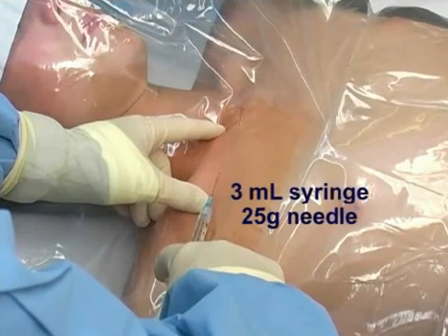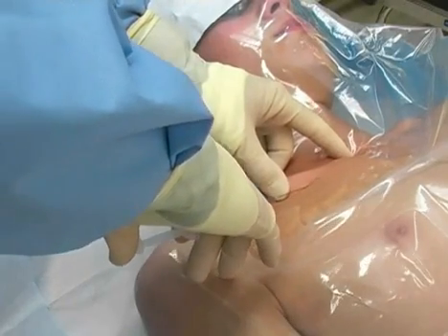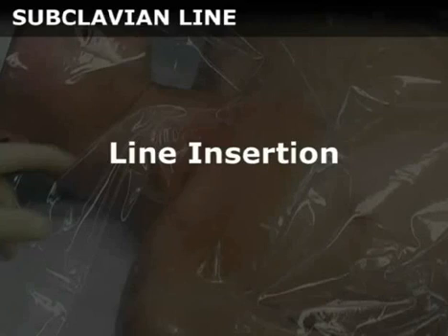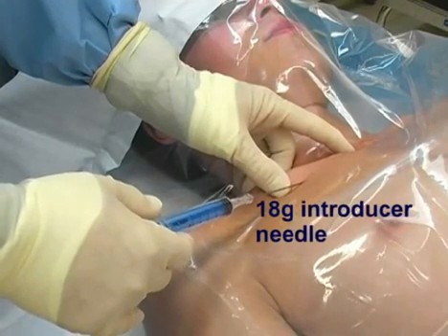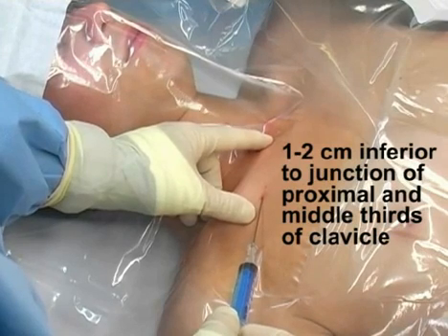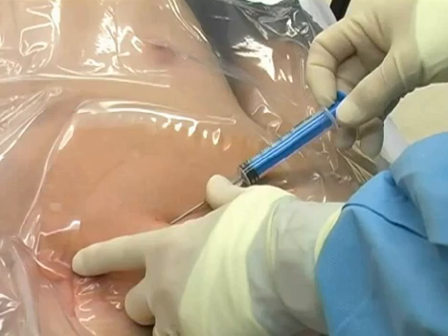Using the 3 mL syringe with the 25 gauge needle, place a wheal of local anesthetic at the needle entry site, which is 1-2 cm inferior to the junction of the proximal and middle thirds of the clavicle. Switch to the 22 gauge needle and anesthetize the subcutaneous tissues and the periosteum of the inferior border of the clavicle. Place the index finger of your non-dominant hand in the suprasternal notch and your thumb on the bend of the clavicle. Insert the 18 gauge introducer needle attached to a 5 mL syringe at a point 1-2 cm inferior to the junction of the proximal and middle thirds of the clavicle. The needle should be held at a 5-10 degree angle relative to the chest wall and advanced until it contacts the clavicle. Walk the needle down the bone and toward the subclavian vein.